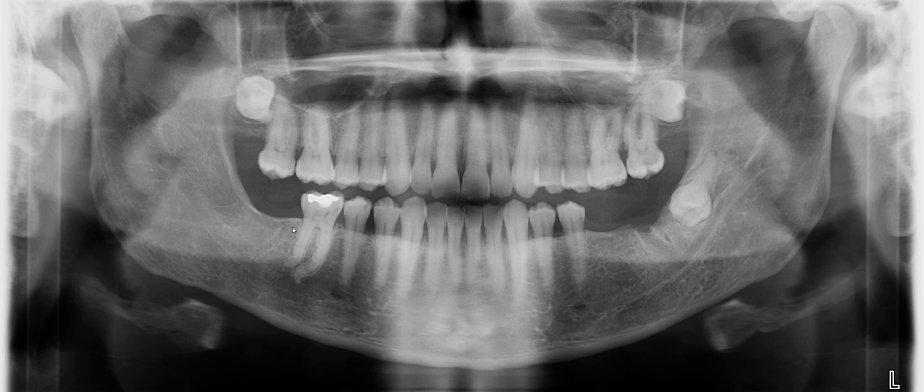Number 32 is missing. Is there anything else you want to point out or anything that is of interest to you?